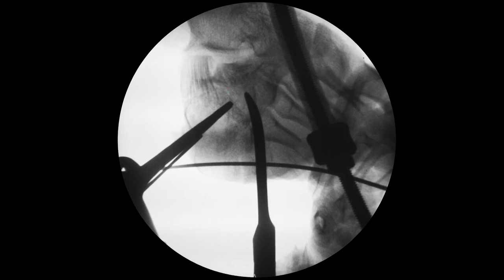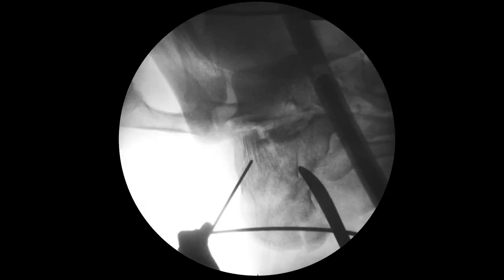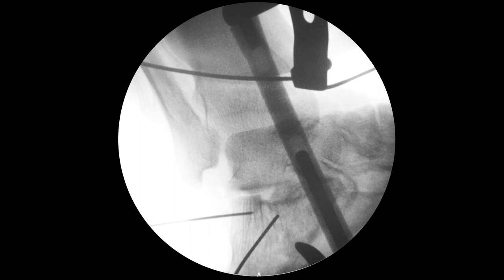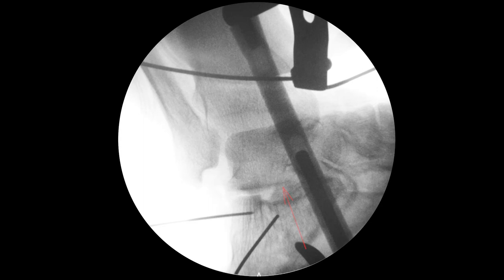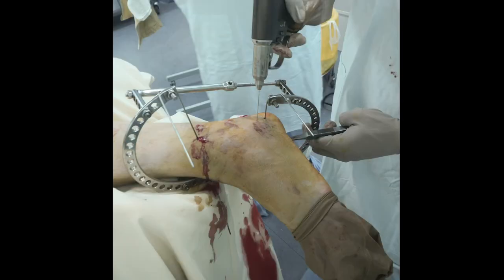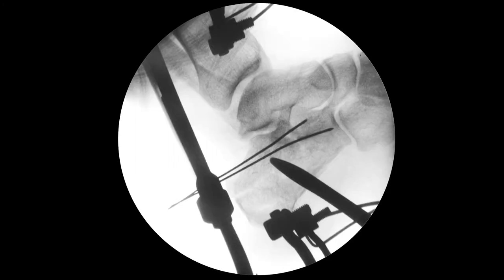In this case, the middle part of the facet was stuck between the calcaneal tuber and the sustentaculum tali, so a gap between them became the optimal window for the reduction tool, which was inserted through a stab incision on the medial surface of the heel above the distractor's wire. Such a small vertical skin incision near the wire on the medial surface allows relief of skin resistance during traction and achieves better efficiency of the distraction device.